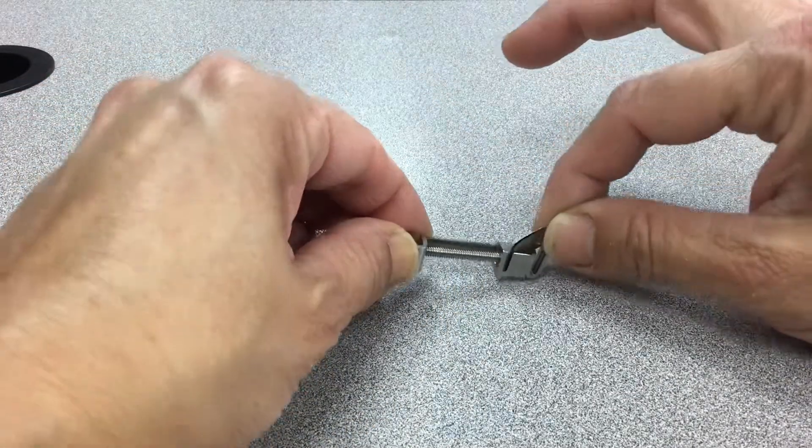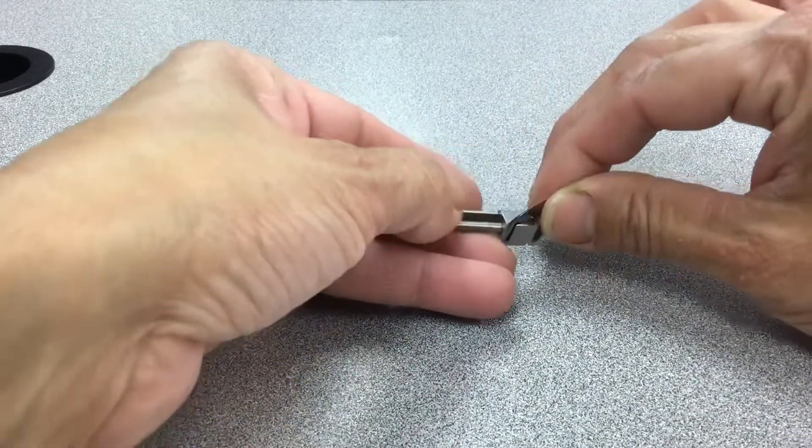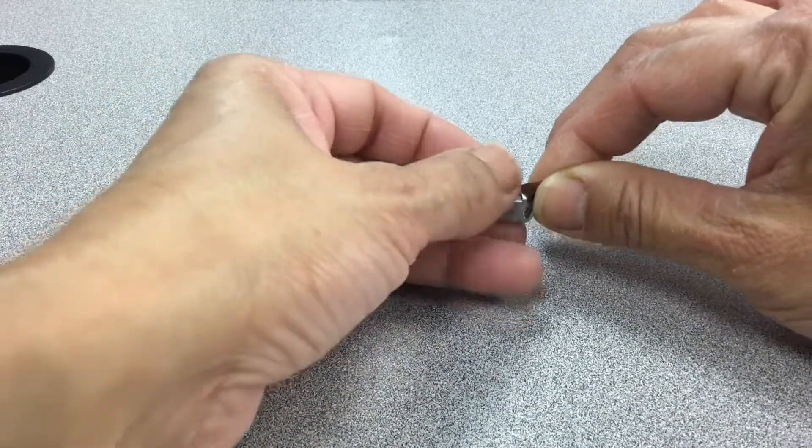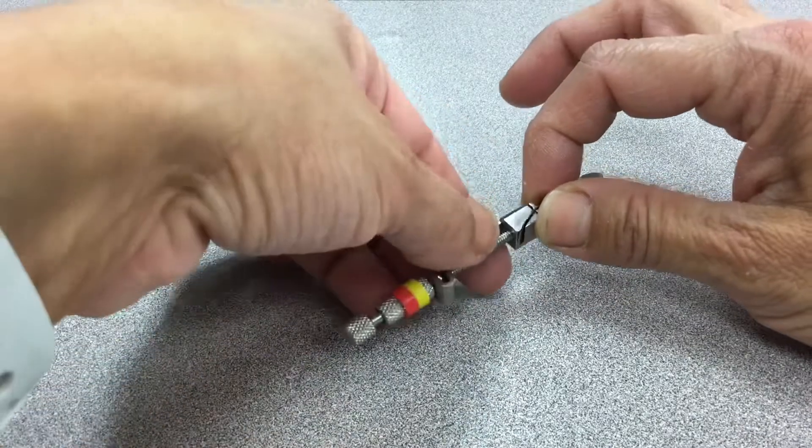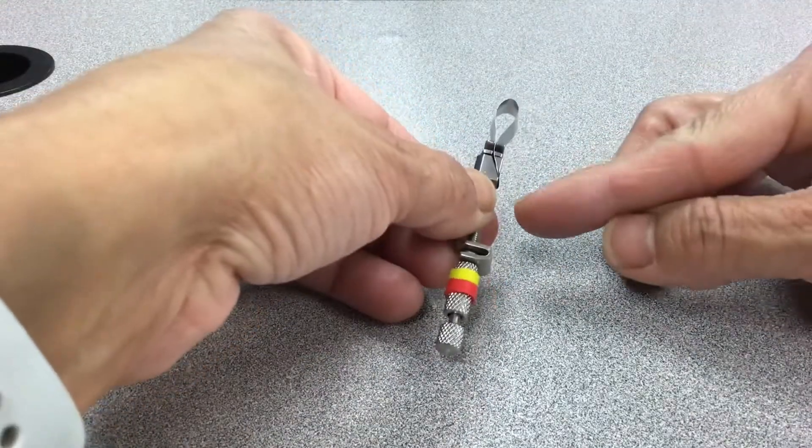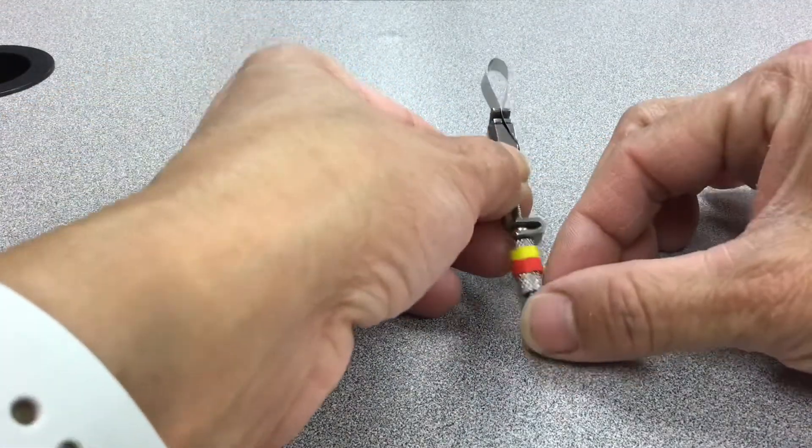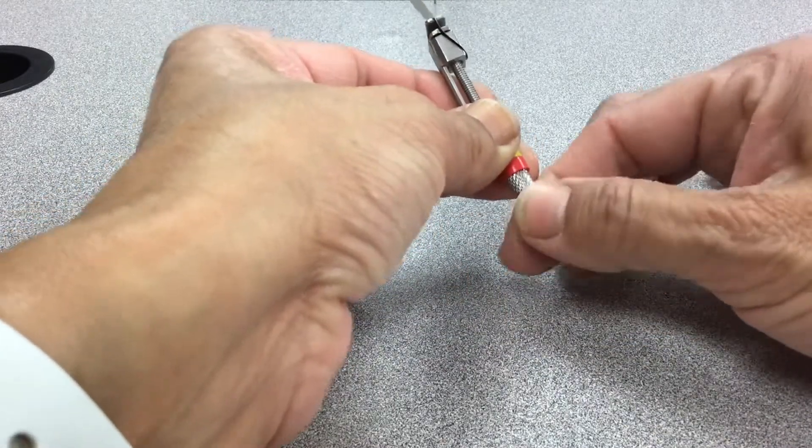You place this in here, and then you stick it out like this. Then what you're going to do, there's a little area here, you close it, tighten it up.